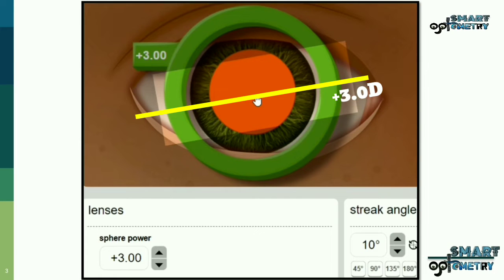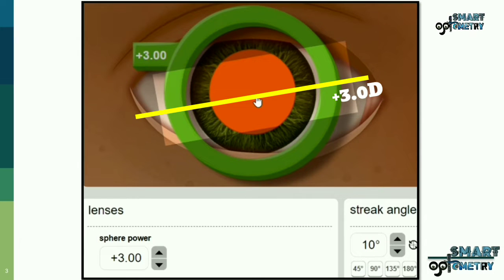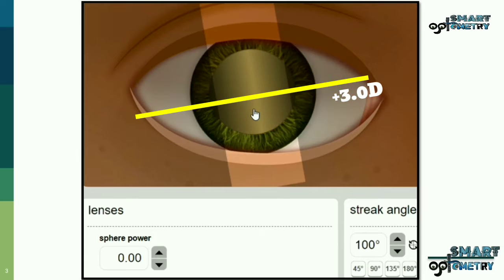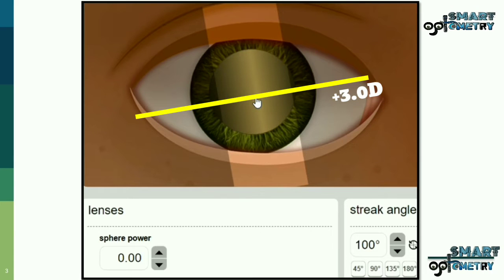Now we will move to the other meridian and neutralize it with another spherical trial lens. As our one meridian is 10 degrees, the other meridian will be 100 degrees. In this meridian also, the movement is with, so we will neutralize it with a trial lens having against movement, or a plus lens.